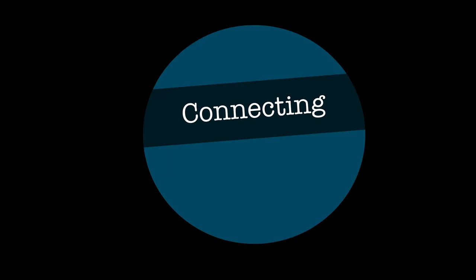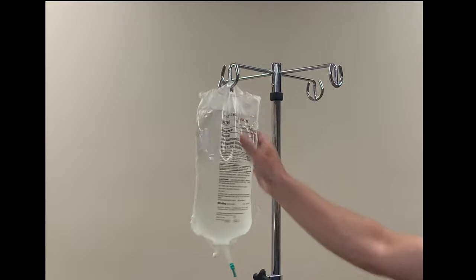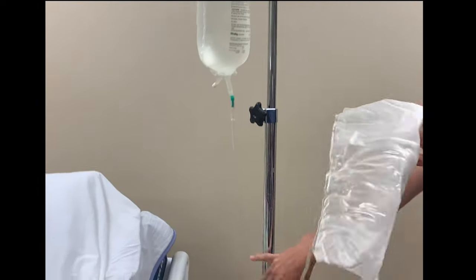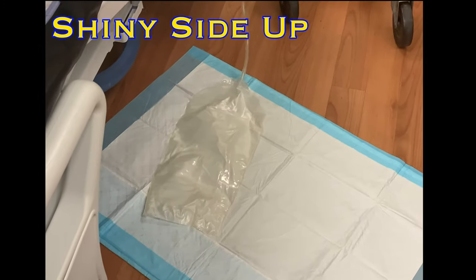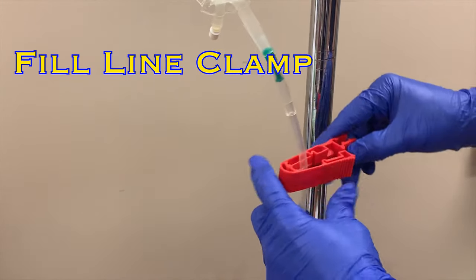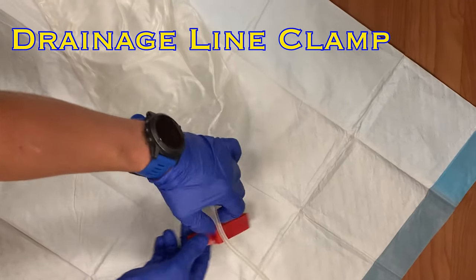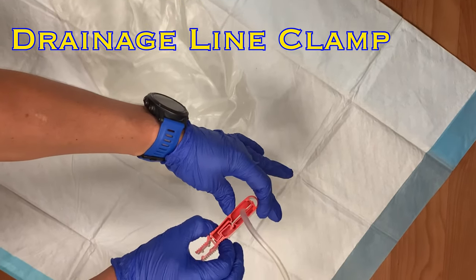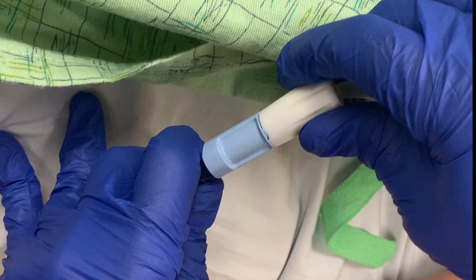It's time to connect the patient to the UltraBag system. Begin by hanging the dialysate bag on an IV pole. Now take the drainage bag, and with the shiny side up, place it on the floor beside the patient. Take one of your red UltraClamps and clamp directly beneath the dialysate bag — this is your fill line clamp. The second UltraClamp should be placed directly above the drainage bag — this is your drainage line clamp. There is a third clamp used during this procedure, known as the patient clamp or the transfer set, and it is attached to the Tankoff catheter that comes from the patient's body. When not performing dialysis, this clamp should always be closed.